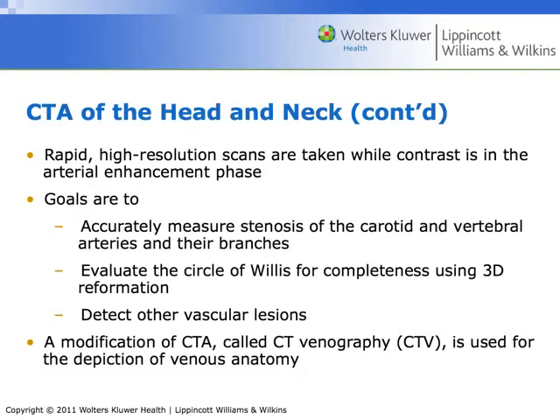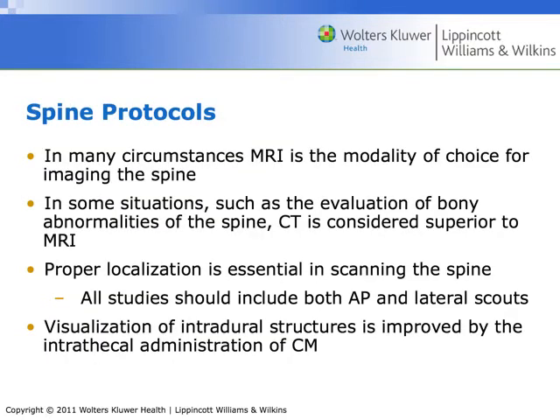So I might set my bolus tracker now off of the jugular vein so that I make sure that I've got nice jugular enhancement, like venous enhancement of the contrast versus arterial enhancement. But that's pretty rare.